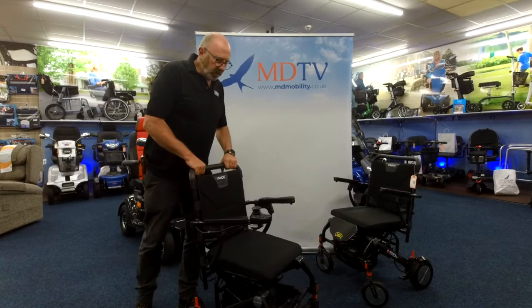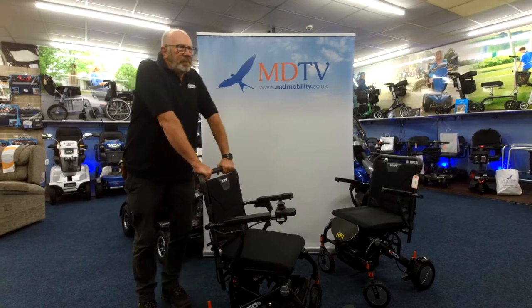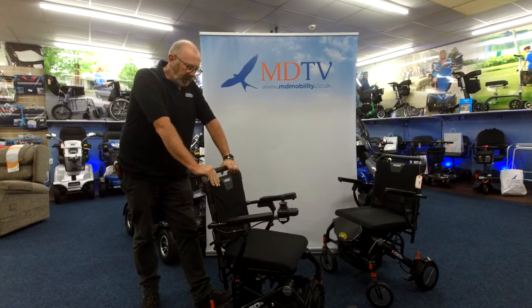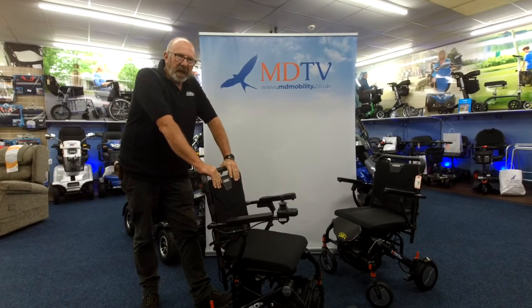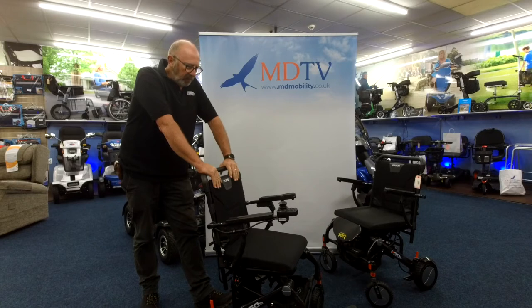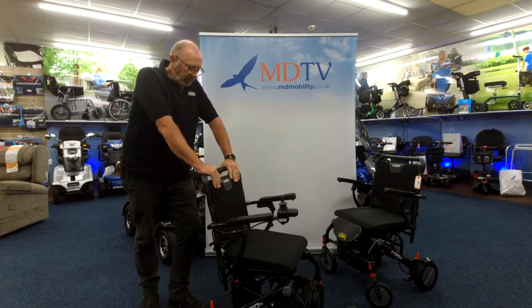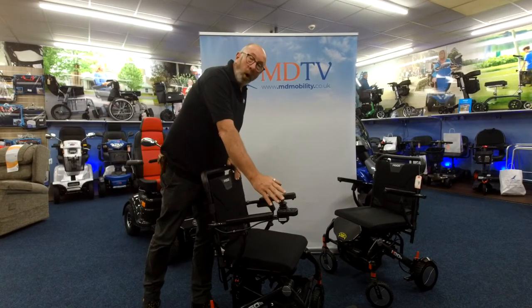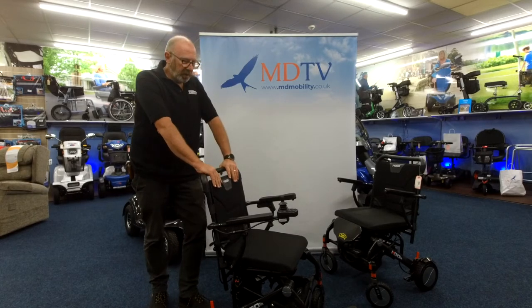The reason for this video this morning is that we had three, maybe four customers who loved the idea of this. The wife or the husband could lift them into the back of the car — it wasn't a problem at all. But the problem was that the person sat in the power chair didn't want to drive it with the joystick control we have here, or couldn't drive it, depending on the circumstances and the person themselves.